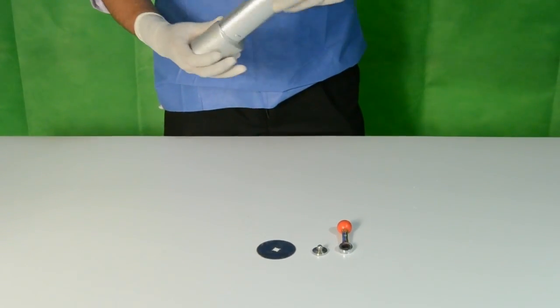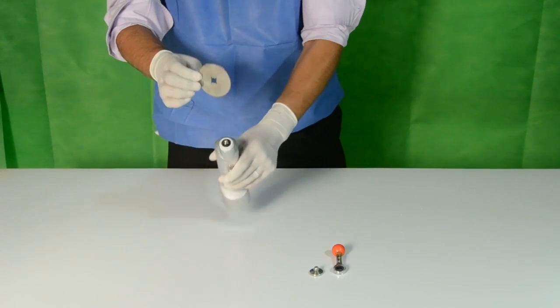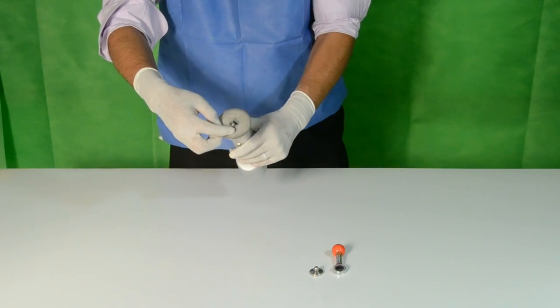The serrated blade is placed on top of the handpiece, watching that blade entries correspond to the handpiece prominences.